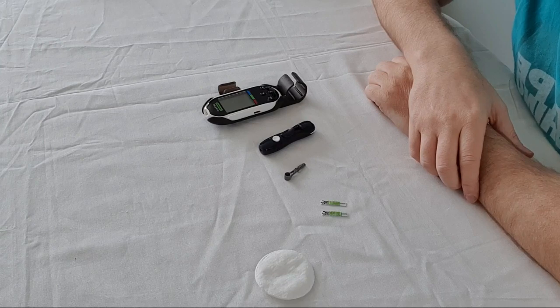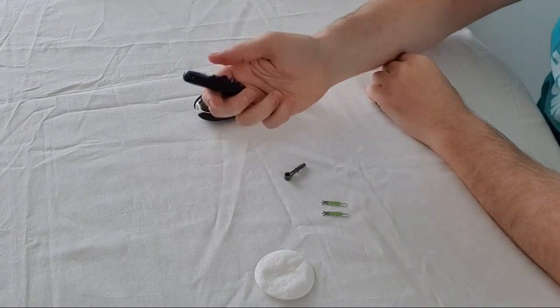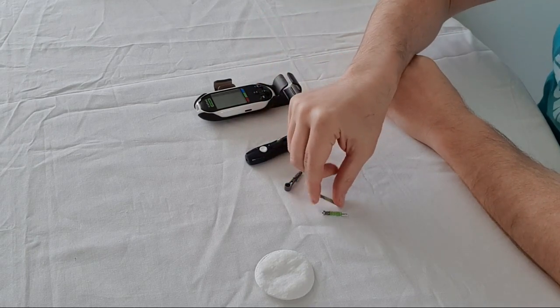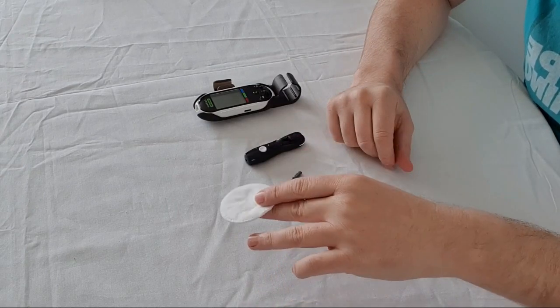Okay, so what you're going to need for this is your glucometer, your lancet device, obviously the needle that goes in, testing strips, and a bit of cotton wool.